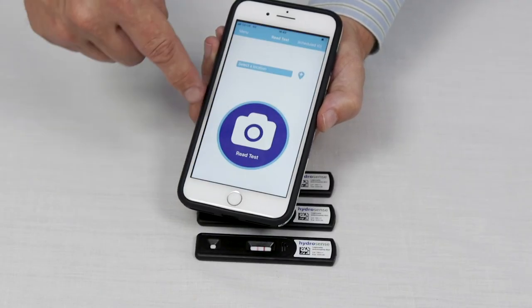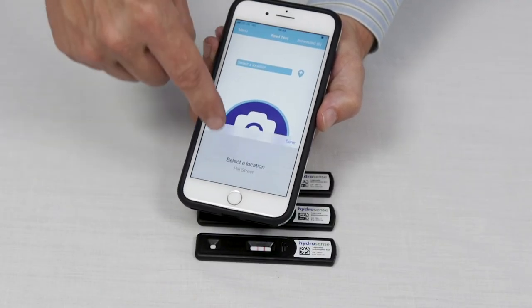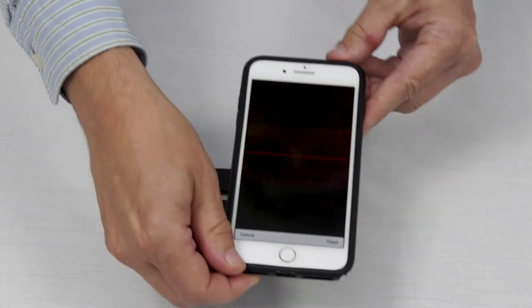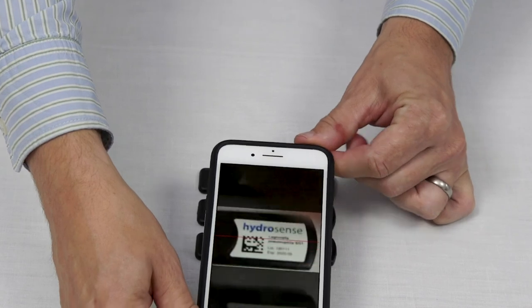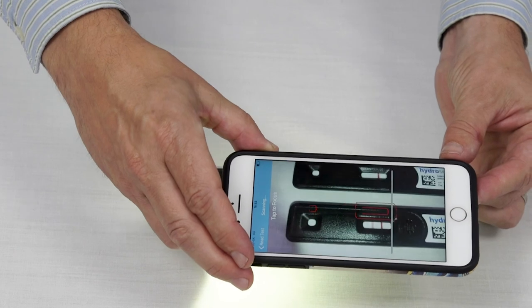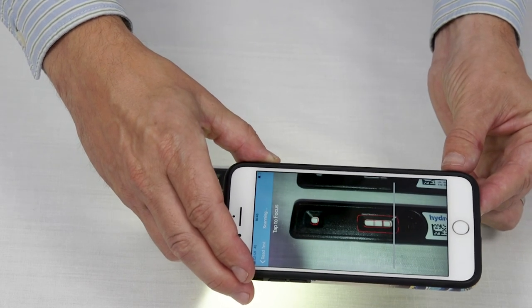To use the app, launch the app, select a pre-programmed location, and click read test. Scan the barcode and then read the test by matching up the image on the screen with the cassette.